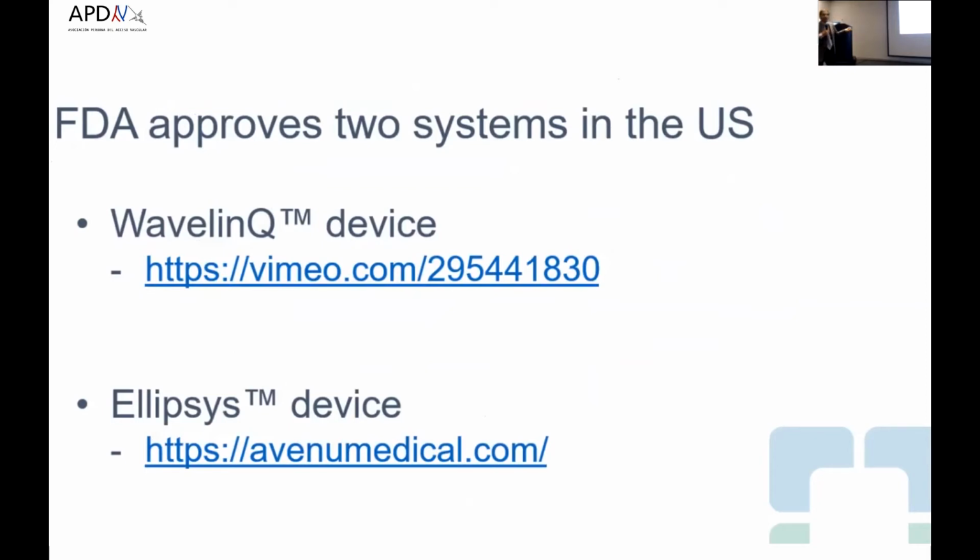The problem is still the same. Because these are deeper vessels, first of all, selecting the right patient is equally important. You need to have vessels that are close to each other, no more than 2 or 3 millimeters apart. If the vessels are far apart, then obviously the cannula is not going to work, and you're going to create a major hematoma in the forearm.